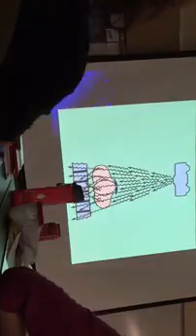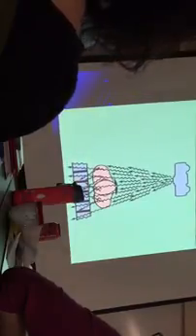You have primary radiation coming down, and if this was a perfect setting, you would have X-rays just going right through it, right? But it doesn't work that way. Some of them will hit these lines and they will be absorbed. You'll end up with grid lines. Also, another problem: the scatter radiation that is created, because it takes different angles. Some of them are going to come this way, and they're going to be absorbed by the lead lines. Make sense?